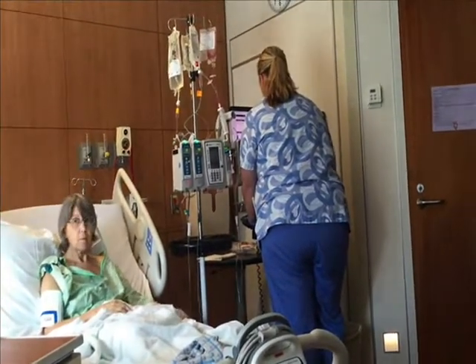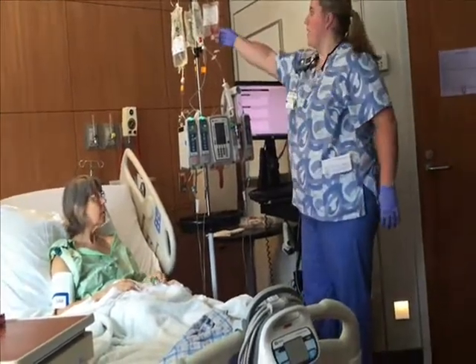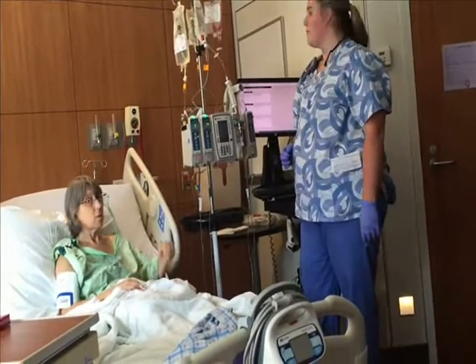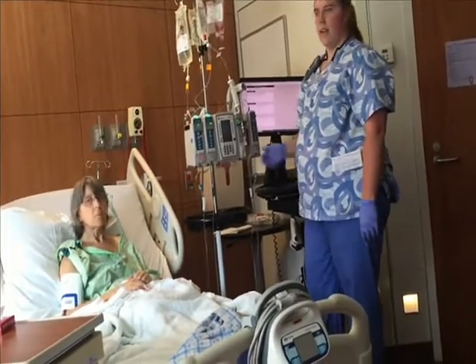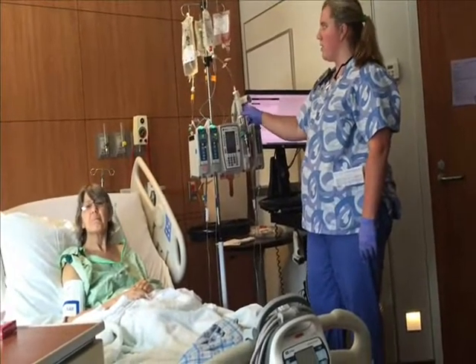Now, does it keep drawing from that bag, or do you have to pull the plunger again? Yeah, I have to completely empty it. So you use that plunger again and draw it out of the bag. Yeah, and then I flush it a couple times. Well, I flush it once between each bag too. I gotcha. This bag. Yeah.